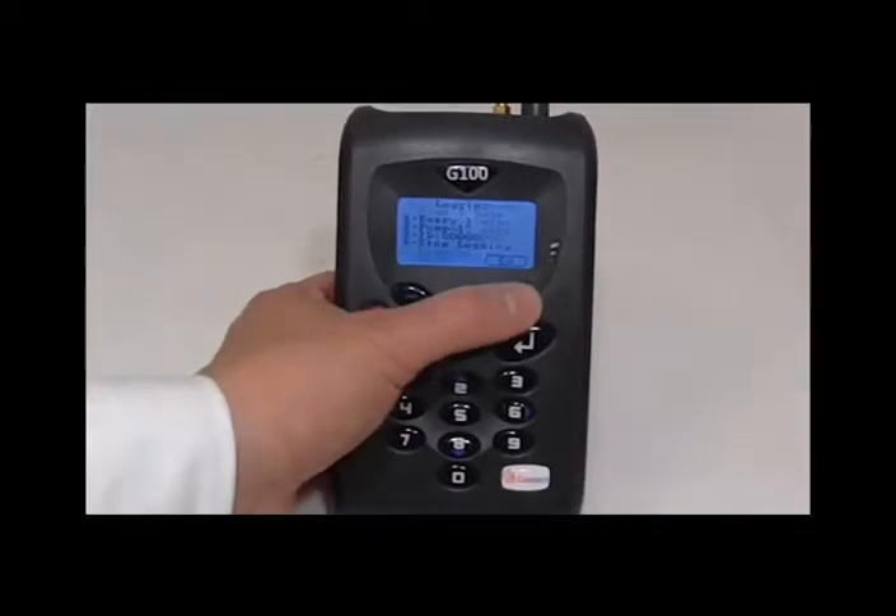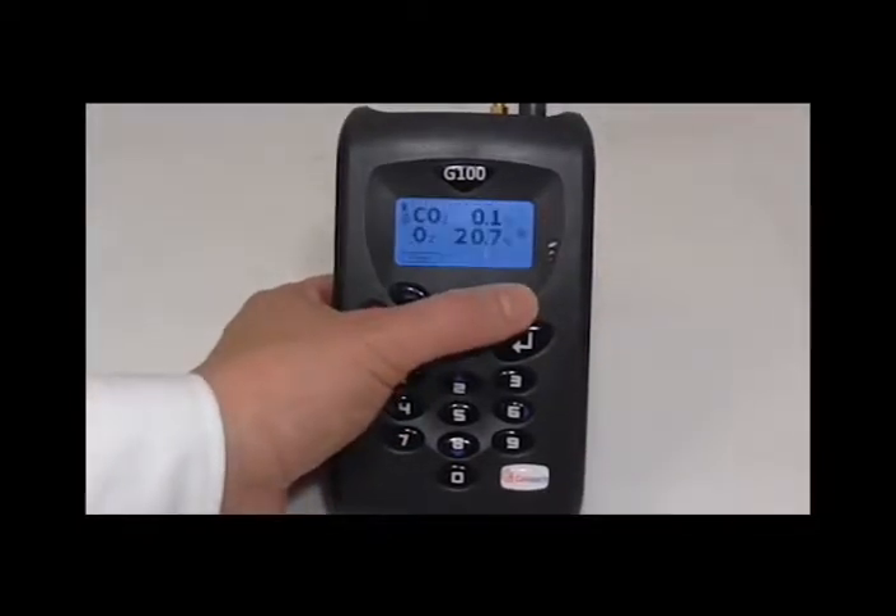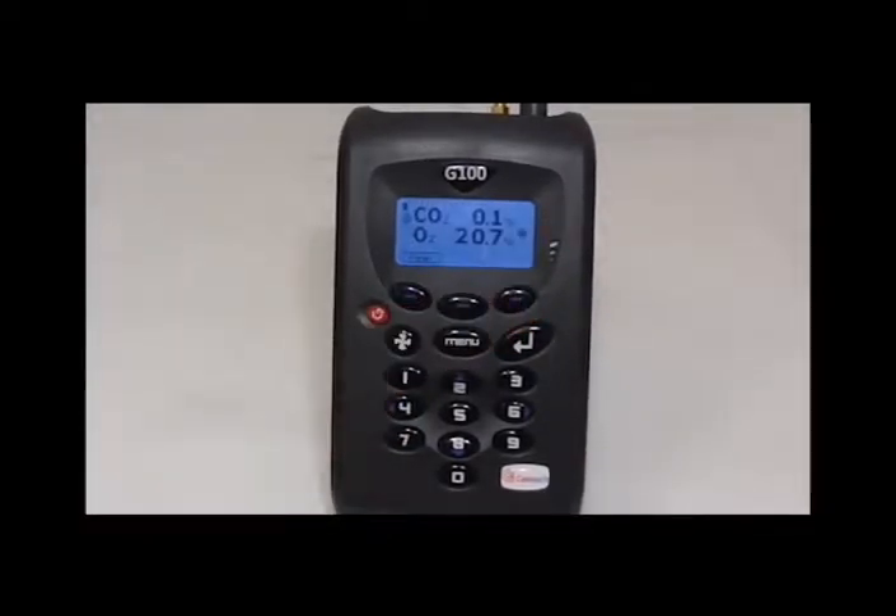Leave the instrument until it runs out of battery. Once the instrument is charged, turn it back on and view the readings by pressing 4 in the menu. Divide the total by 60 and this will give you how many hours the instrument lasted for. The battery should last for a minimum of 8 hours.